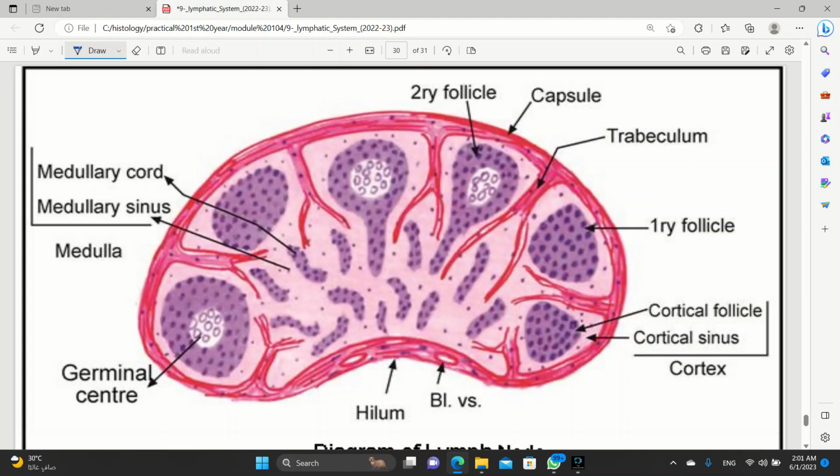What is that? That's a lymph node. And the capsule got thickened. Here's like some, that's the width of the capsule, and finally it became like this. So what happened? Some sort of thickening where the nerve and the arteries enter, and then veins and the lymphatics exit. So that's the hilum, basically. That's a blood vessel. Hilum, blood vessel. That's the capsule. Okay, and we're talking cortex.